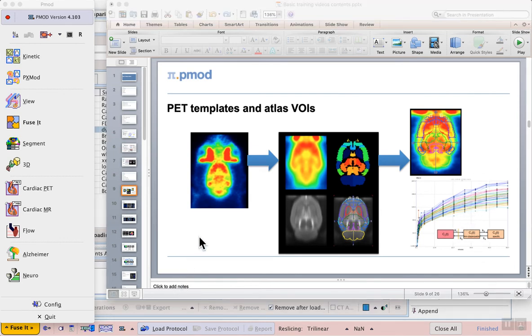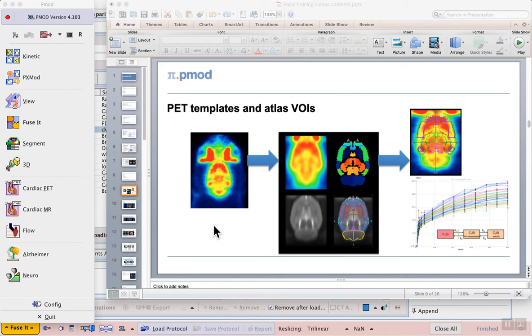In this exercise we'll use the FUSE-IT tool to perform spatial normalization of the RAT-BRAIN FDG data shown here, so that we can extract time activity curves for kinetic modeling. Therefore the output from this exercise will lead you directly into Section 4, Exercise 1, where we'll perform full quantification of glucose metabolism for the same RAT-BRAIN example.